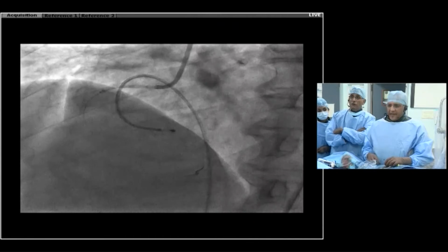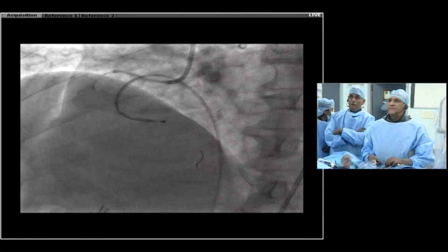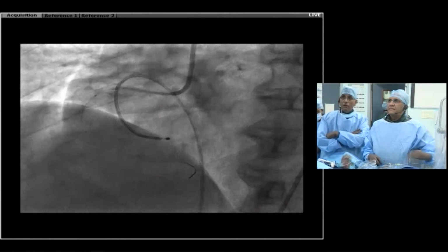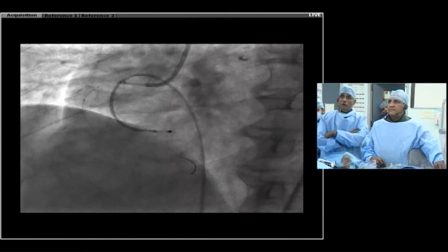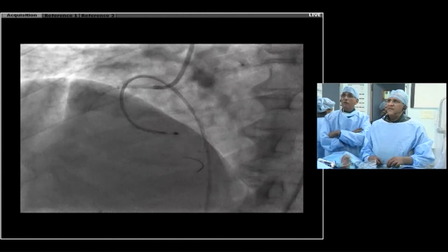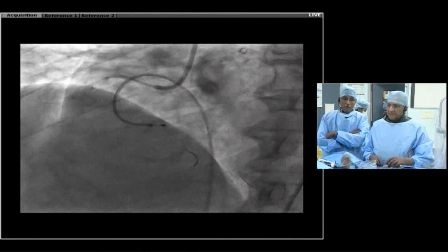Basically, we've dilated it there already, but we'll do it once more. I'm not certain it was. Little more, little more. I need to be certain that the balloon comes up there nicely before I take the stent, because I think it's right around the bend, of course. You want to center the marker on that calcium area.